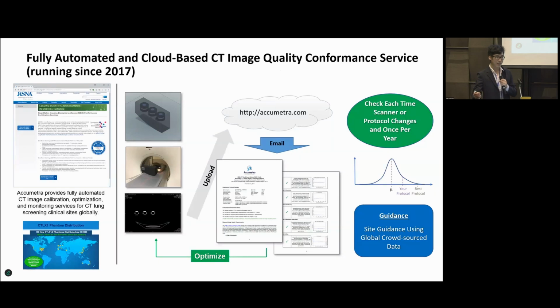So, in light of this, I think the question is, first of all, how do you even measure... Sorry, so let me step back. There are a couple of different factors that contribute to this volume difference or this volume variation. There's variation that's due to the scanner.